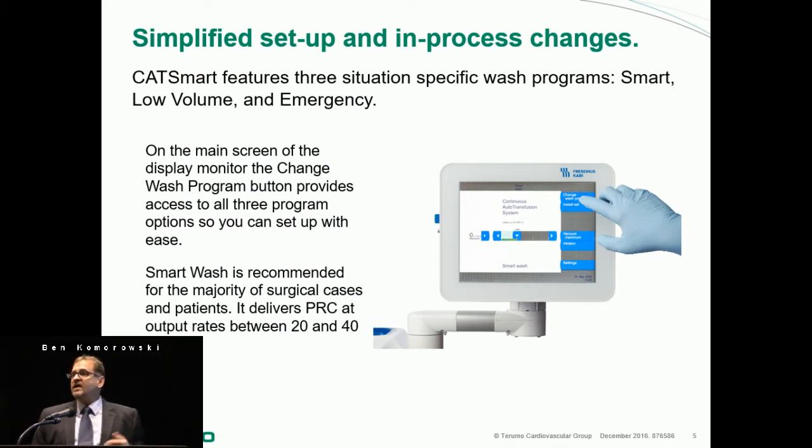They have basically streamlined the number of different modes. If you remember the CATS Plus or CATS Classic, there were tons of different modes. Now there are essentially three: a CatSmart Wash, a Low-Volume Wash, and an Emergency Wash. What you would use most of the time in your practice would be the Smart Wash, which delivers red cells anywhere from 20 to 40 milliliters per minute.